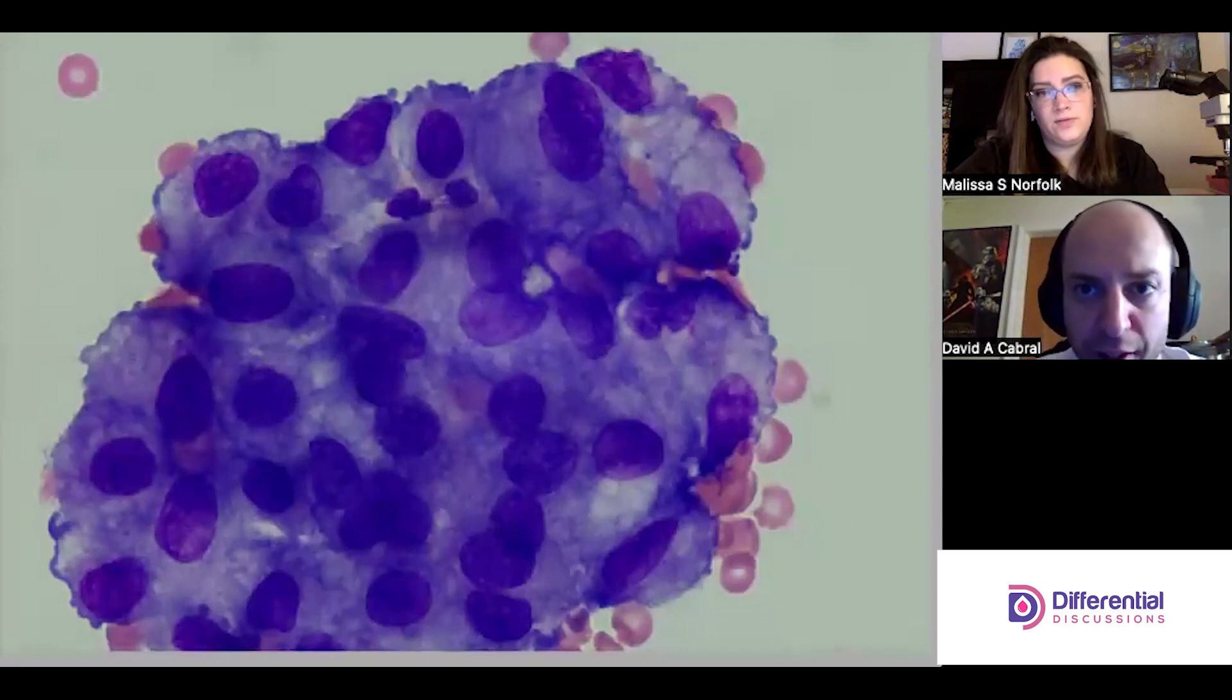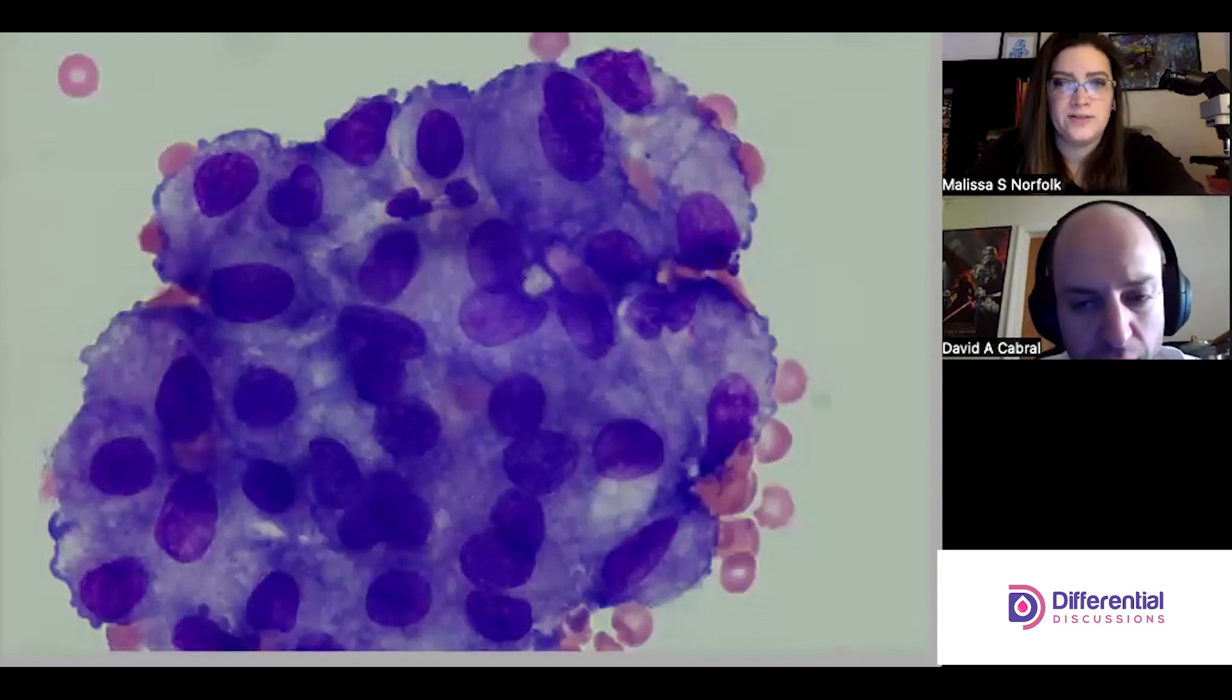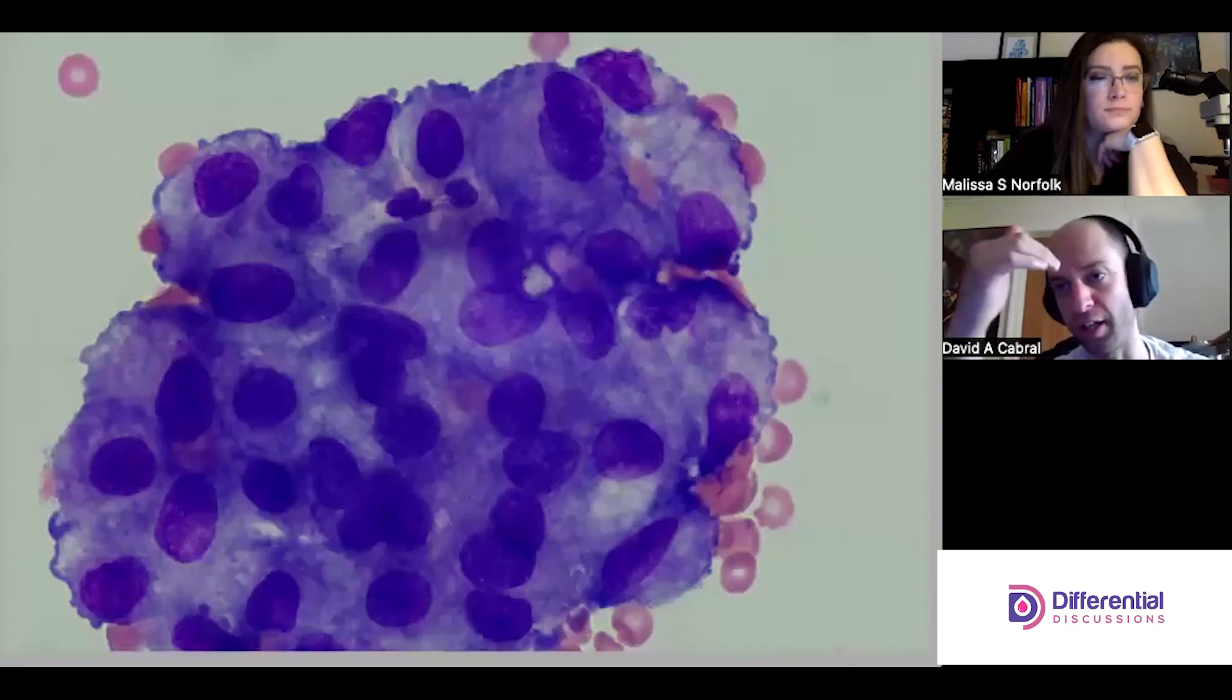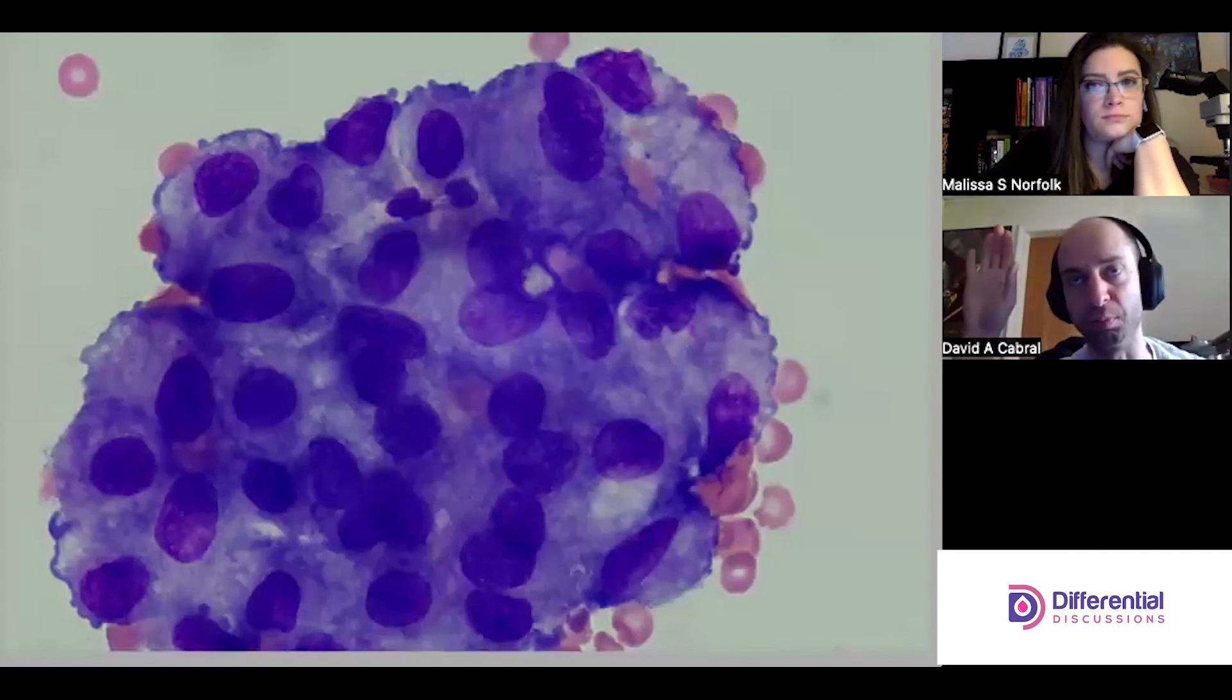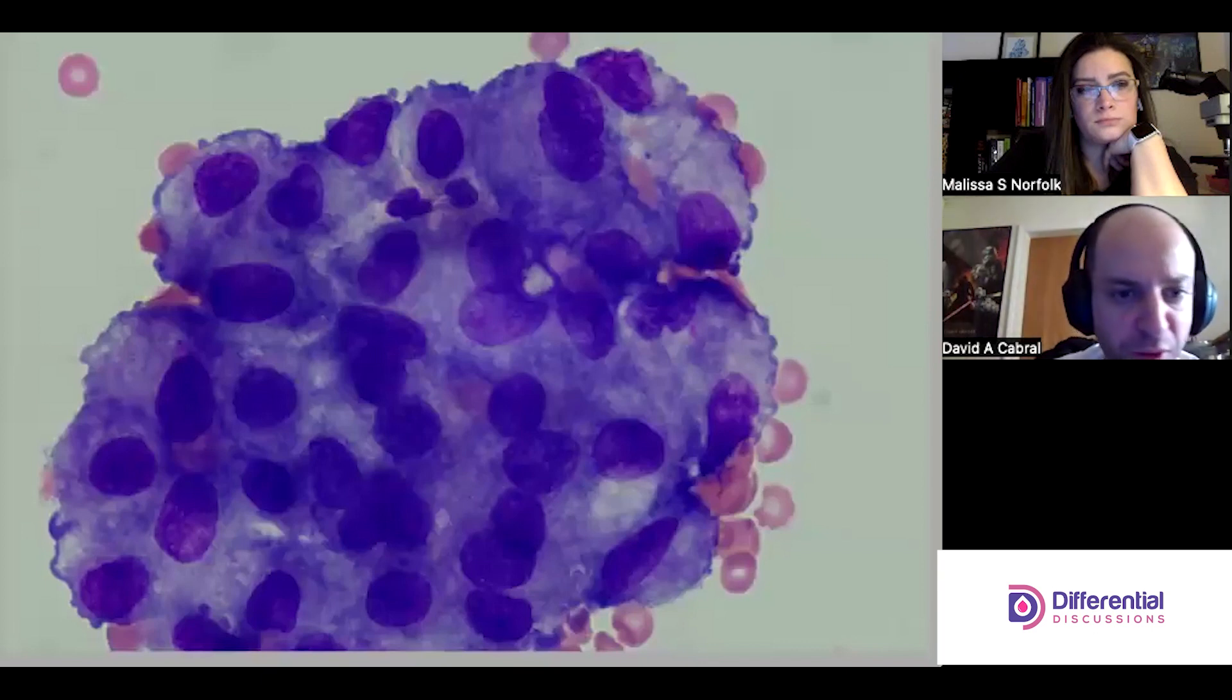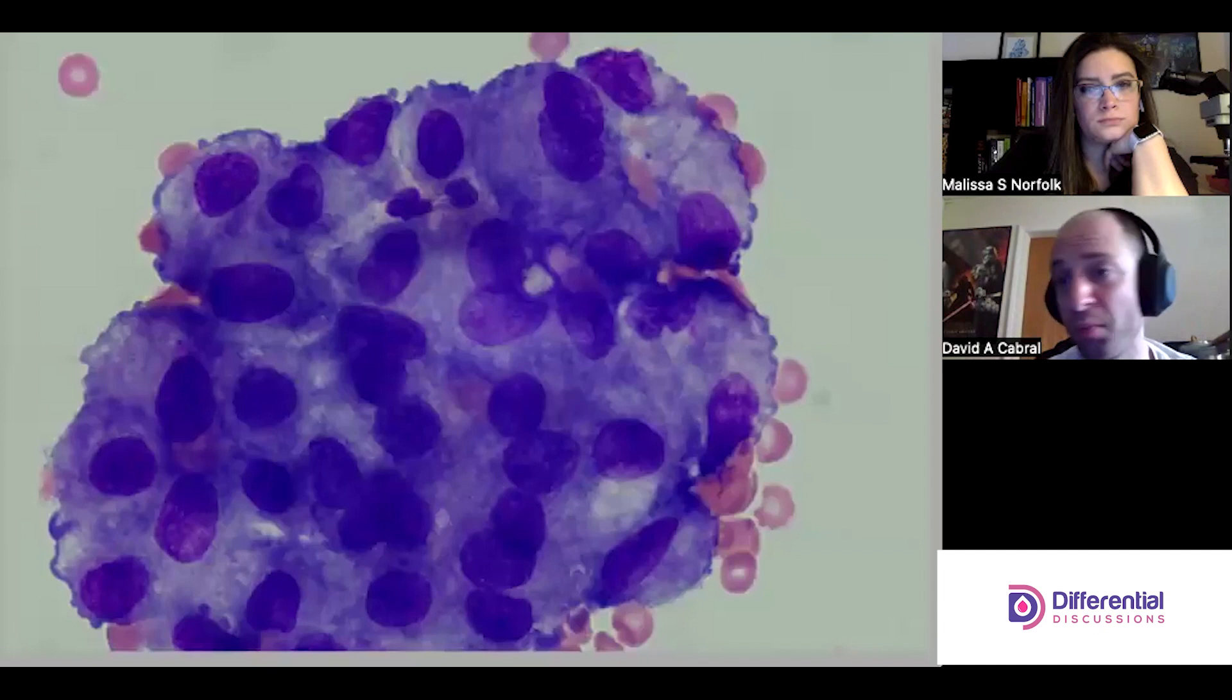So it still really doesn't look quite 3D to me. Agreed. But I guess I'm less intimidated, but there's some stuff that's like you know the windows aren't quite as defined. So typically with mesothelial cells, where they contact each other it'll have some kind of a window where you can see clearly like the cell's boundaries stop and the next cell starts, not completely clear. So I also try to be really sensitive to the nuclei being kind of uniform with one another. After all, these are all kind of like generally sister cells with each other so they should look relatively similar. I think overall all I can say is like I'm on guard I guess.